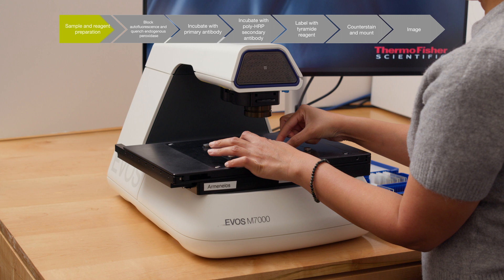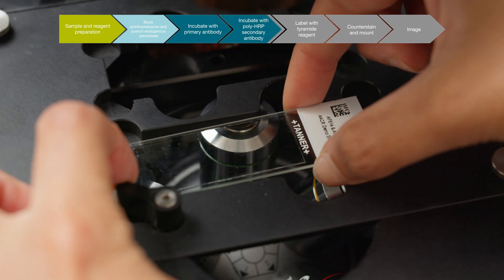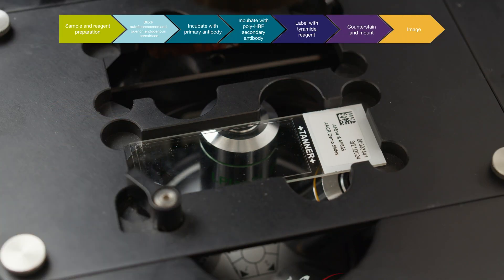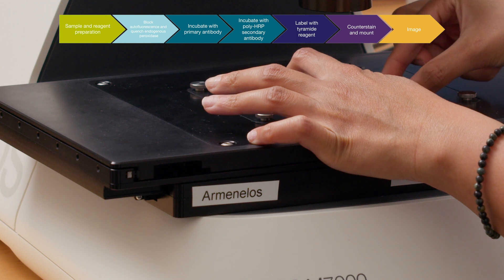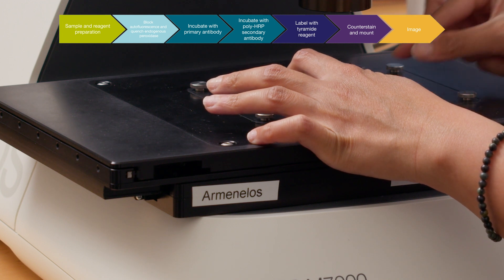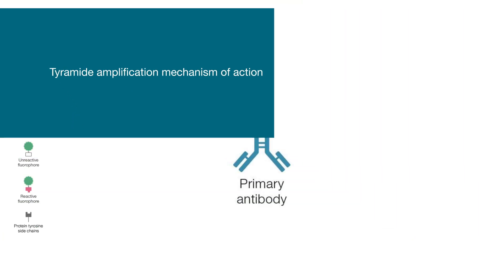This video will demonstrate how to use the Tyramide SuperBoost kits for staining tissue, starting from an unlabeled FFPE tissue sample on a slide. The labeled tissue will then be ready for imaging on any type of fluorescence microscope.